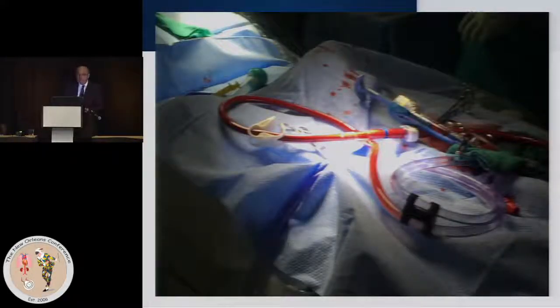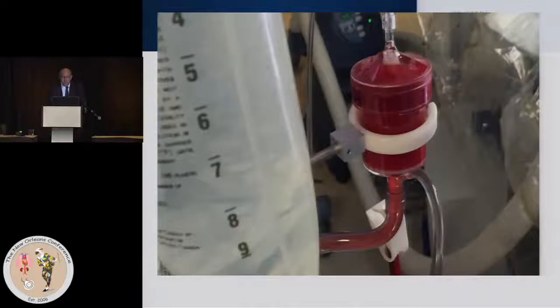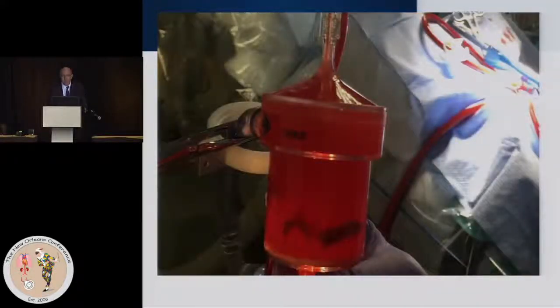Obviously, you have to be extremely careful to make sure that there's no air that's trapped within the circuit. We hooked her up. This was on Monday afternoon, 3 or 4 days ago. And moments after we started, my fellow took this picture with the filter clear, and literally, and I don't have a way to show this to you because he didn't take a movie of it, but literally 3 seconds later, that's what we saw in the filter.